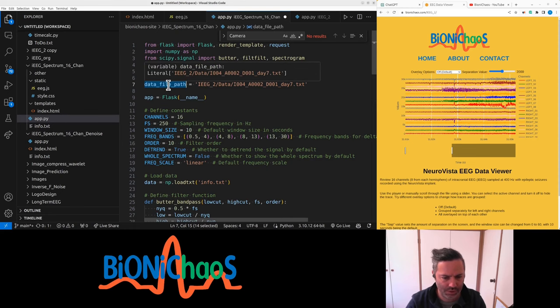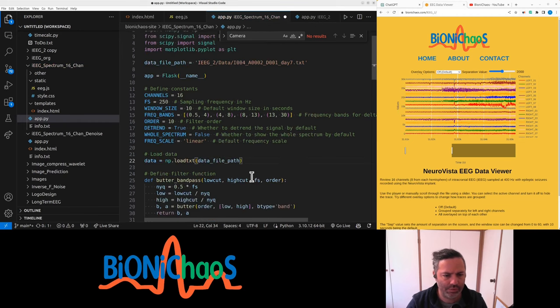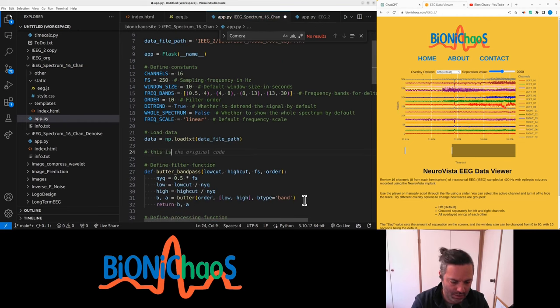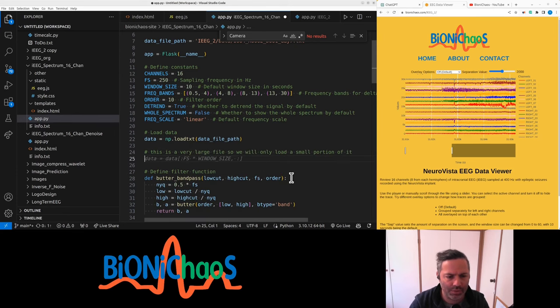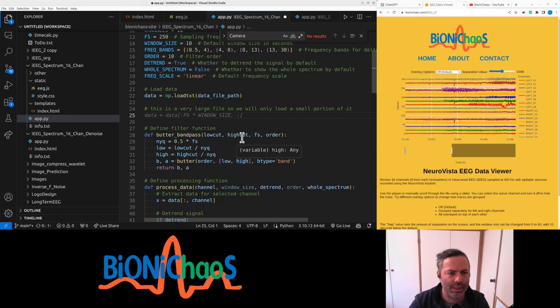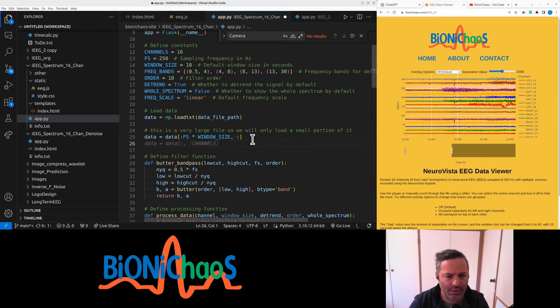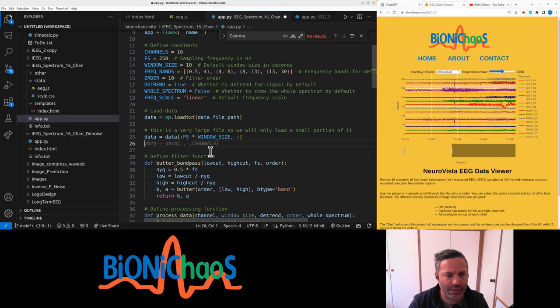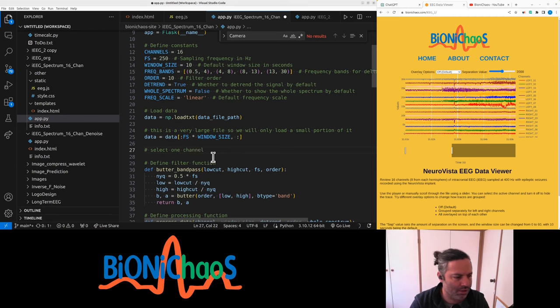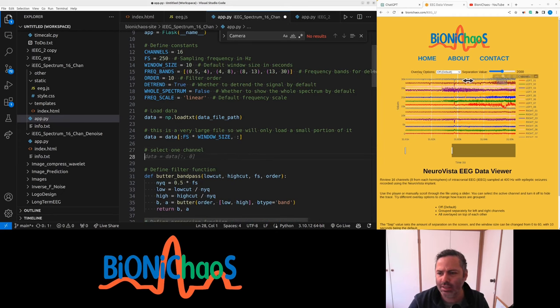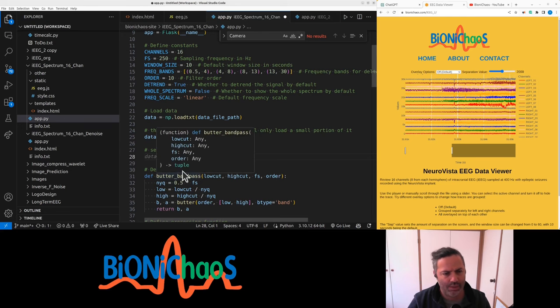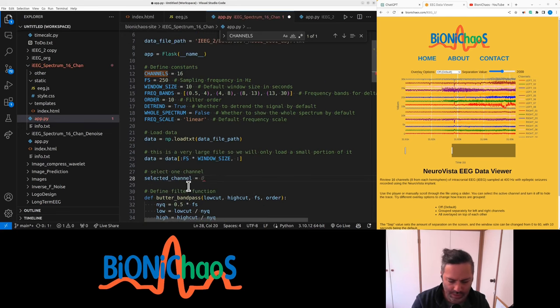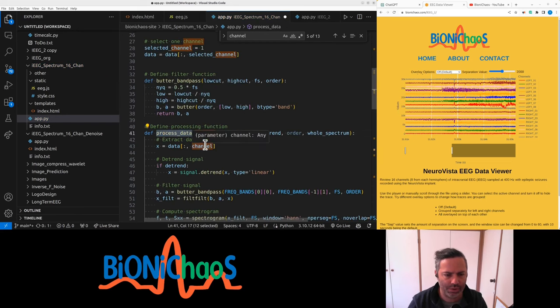This is a very large file. We load a small portion of it, or are we already doing this? Window size is 10 seconds, multiply by sampling frequency, that's correct. I just want to take one channel. There are 16 channels, but select one channel. Eventually the selected channel will be coming from the web application, but currently, yes, zero should be fine. Let's make it one, a channel.